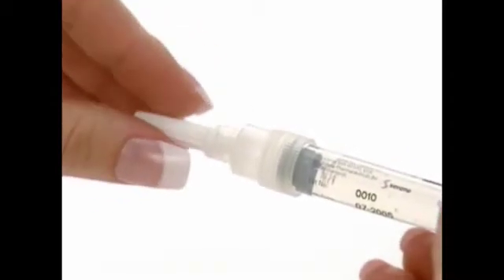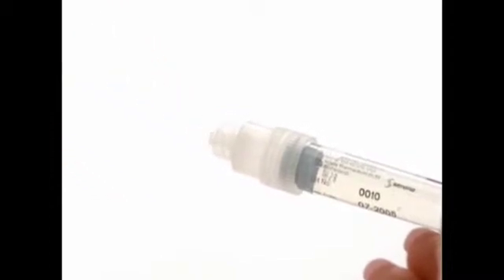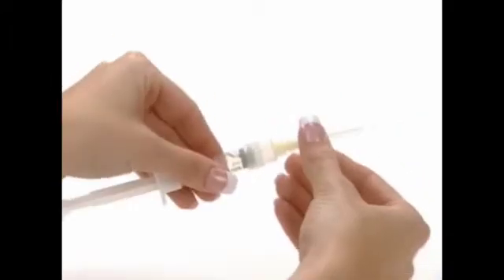Remove the wrapping from the yellow mixing needle. Take the pre-filled syringe and remove the cover. Twist the mixing needle on the syringe and remove the cover of the needle.